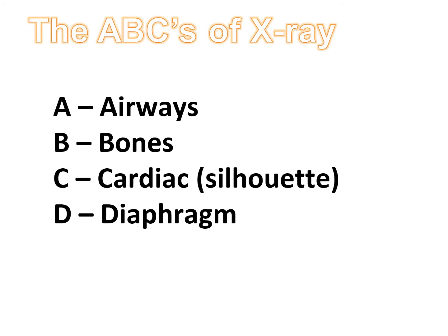It focuses just on the chest X-ray. So we're looking at airways. The one thing we're looking for is whether the trachea is deviated. You want the trachea to be midline, and sometimes it's not because there's a pneumothorax or something, or it could just be the turning of the patient, so they want to make sure that it's centered and midline. You want a good inspiration, so you should be able to see the lungs expanding to about the 10th to 11th posterior rib. Make sure there's good lung detail and an outline of the spinal column.